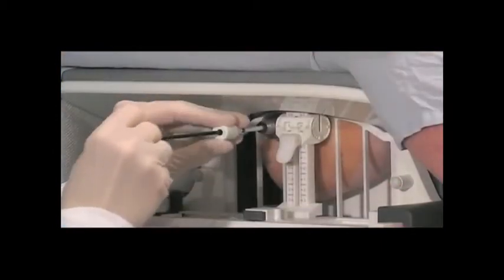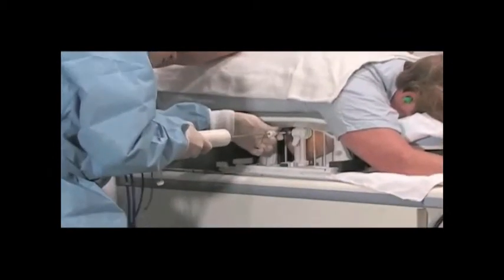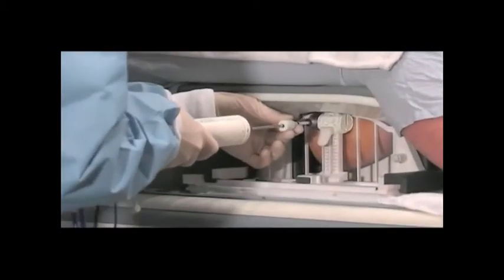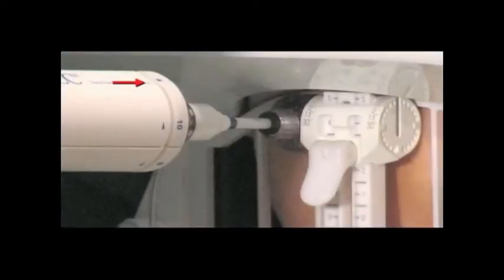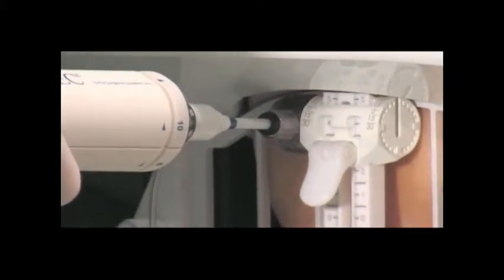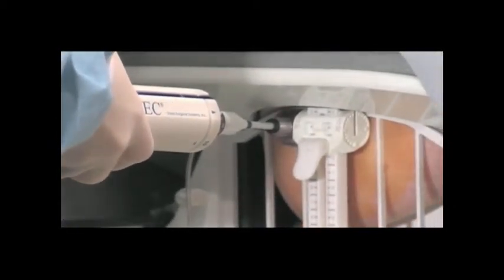Remove the localizing obturator from the introducer sheath. Place the ATEC MRI handpiece into the introducer sheath at the desired starting clock position indicated by the numbers on the handpiece. The flat portion of the handpiece correlates to the cutting aperture. With this surface facing up, your needle will be at the 12 o'clock position. Core samples can be taken at any clock position depending on the location of the biopsy area of interest.